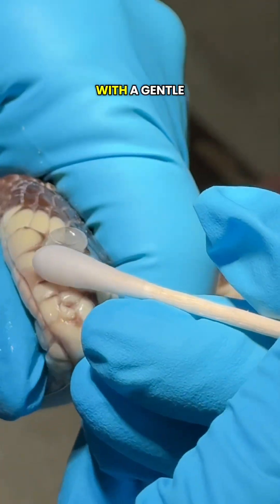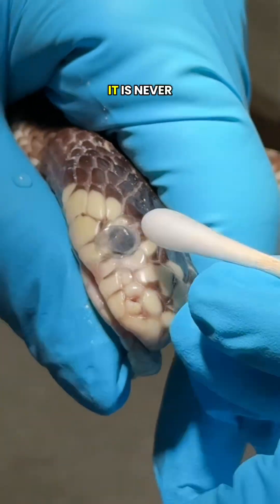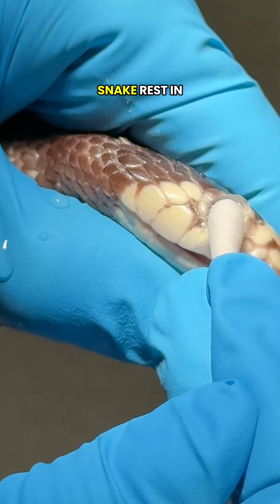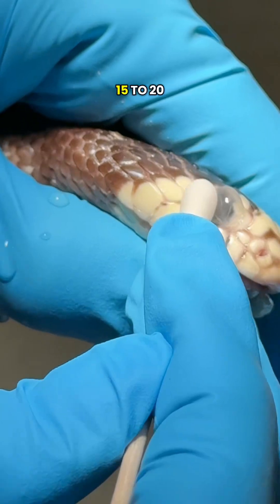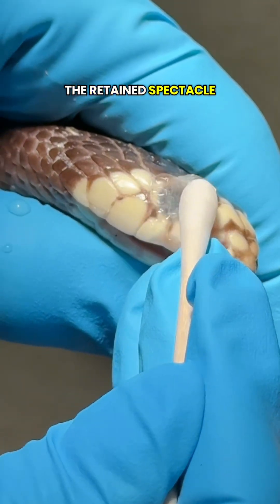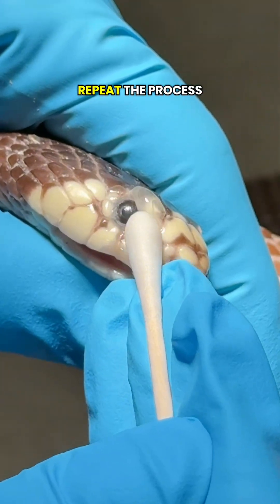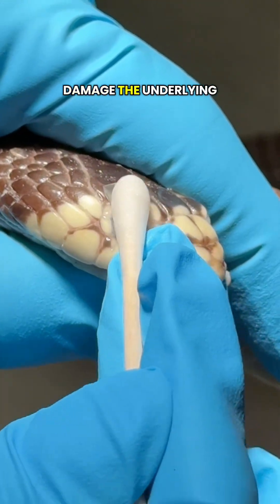To remove it safely, we start with a gentle saline soak, the goal being to rehydrate and loosen the old scale. It is never pulled off dry. We let the snake rest in a warm, humid setup for 15 to 20 minutes. After soaking, we gently roll the edge of the retained spectacle with a damp cotton swab. If it doesn't lift easily, we stop and repeat the process — forcing it will damage the underlying cornea.